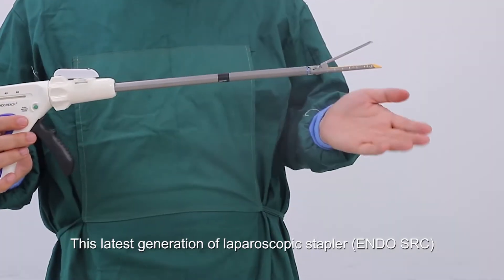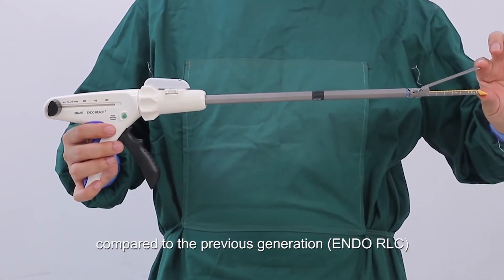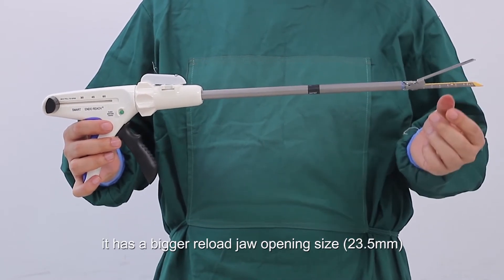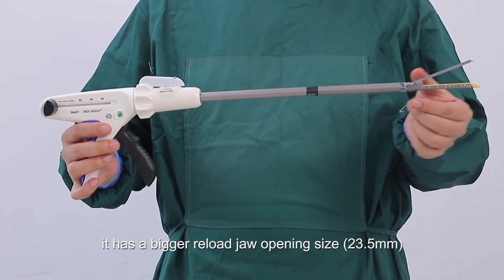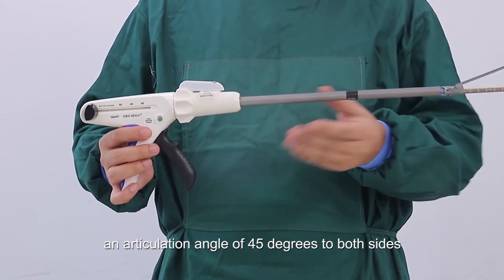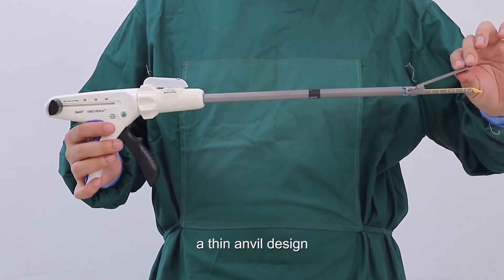Product features and benefits. This latest generation of laparoscopic stapler, compared to the previous generation, also has the tissue gap control design. It has a bigger reload jaw opening size, an articulation angle of 45 degrees to both sides, double safety mechanisms, and a thin anvil design.